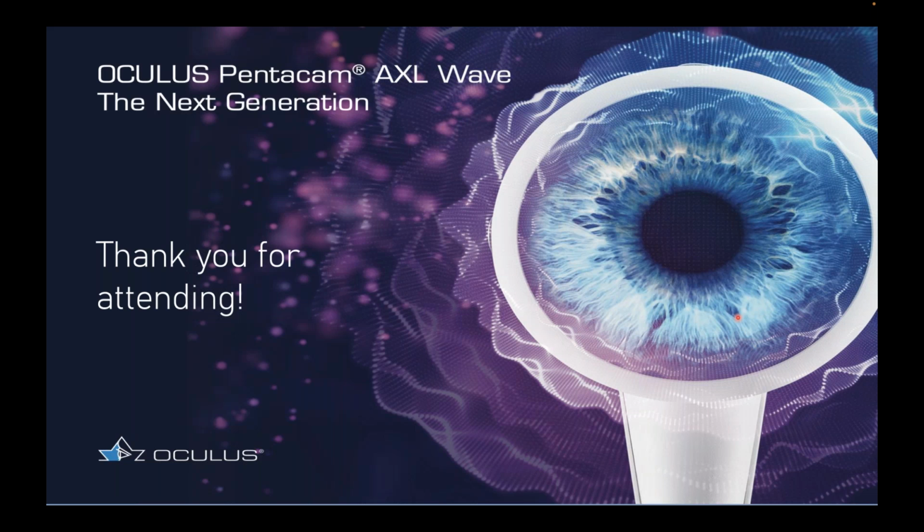I think what holds me back now is that I'm not always confident that the lens I'm going to fit with these higher corrections is going to stay put on the eye all day long while they're wearing it. So I could see that number in 5 years being anywhere from 25 to 50%, honestly, if the lenses and the system for incorporating HOAs were more efficient and more effective. And so I look forward to us continuing to evolve our ability to fit precisely, because that will allow us to incorporate these on more patients than just the ones who really are desperate for it.